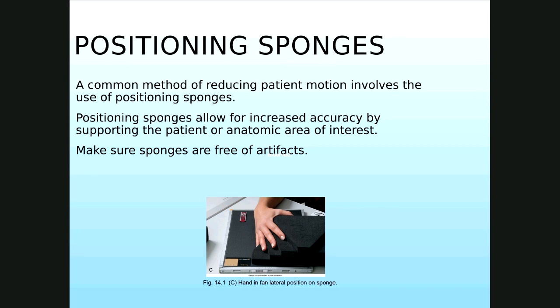The positioning sponges were very helpful. They helped patients maintain positions. They were able to support the patient in the correct anatomical position, aid them in not moving. The downside with this, if you can see the sponge, is that you cannot clean this sponge.